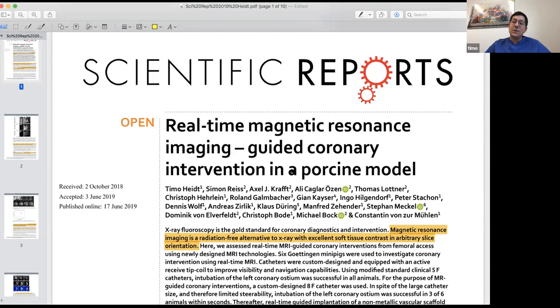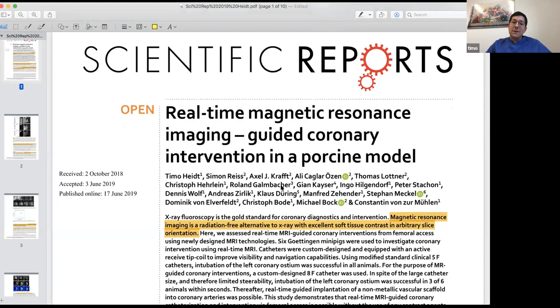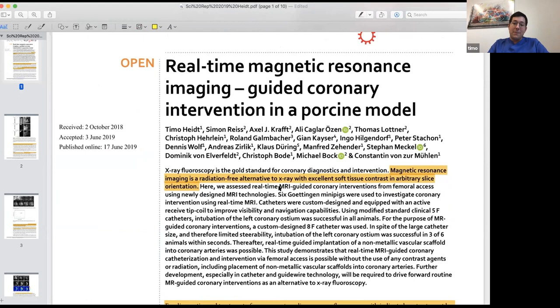As Matthias Friedrich said, there is substantial progress being made in the field of interventional magnetic resonance imaging. We will see the paper of Vivek Mutarango later on right heart catheterization. That's one area where this technique already passed the hurdle towards clinical application. There are others in electrophysiology, EP ablations, and endomyocardial biopsies are on their way.